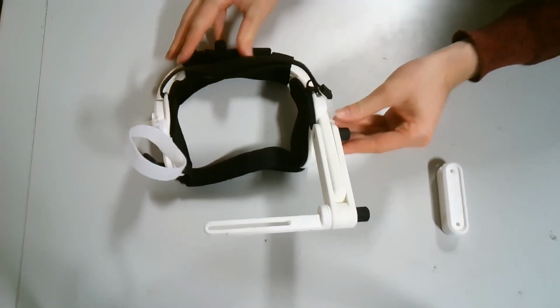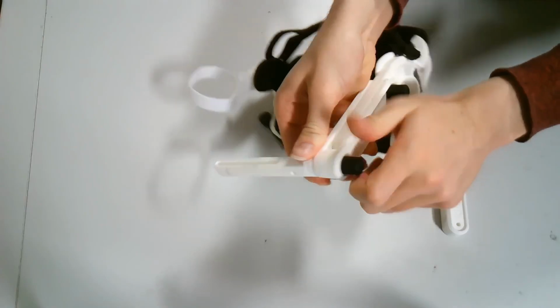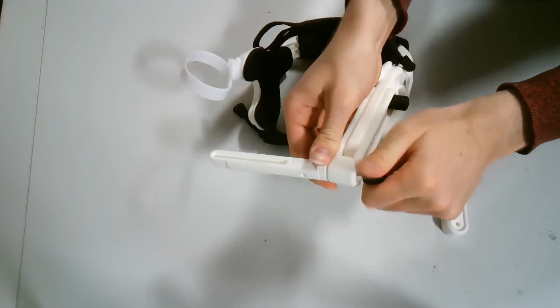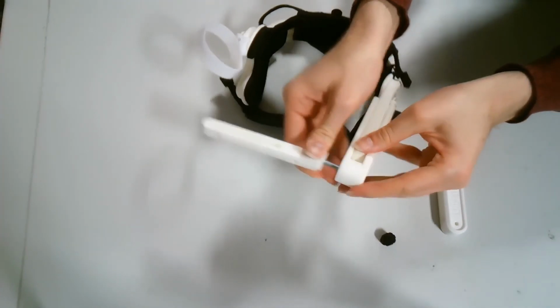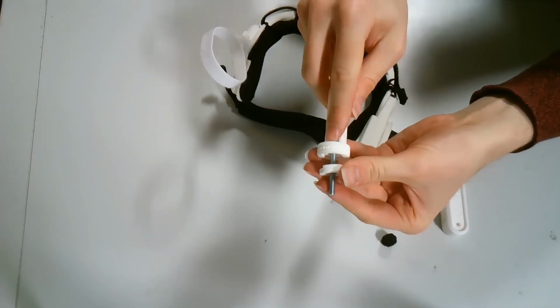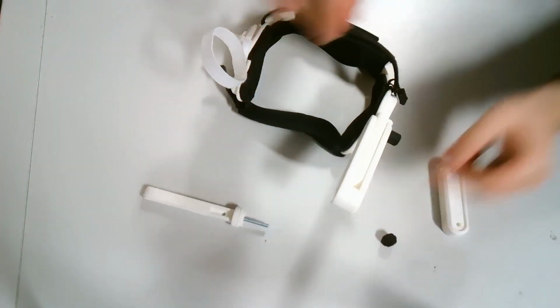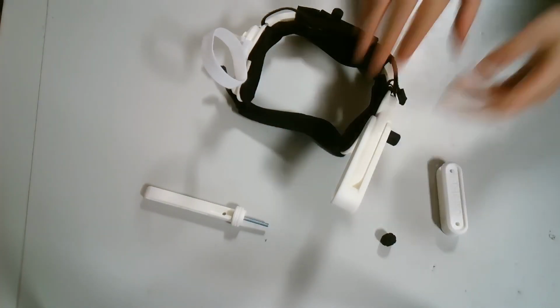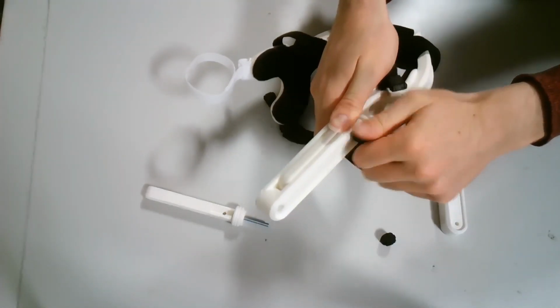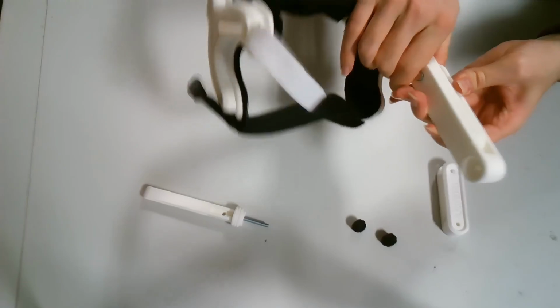You can change the length of the arm. Remove the front arm by unscrewing it from the side arm. Keep the washer together with it. Remove the side arm by unscrewing it from the headset and sliding the arm off.